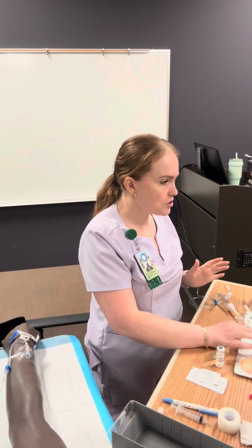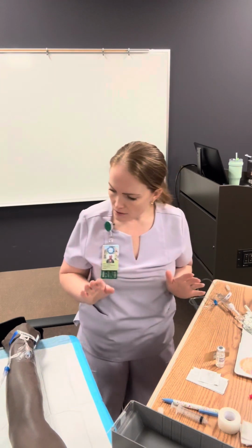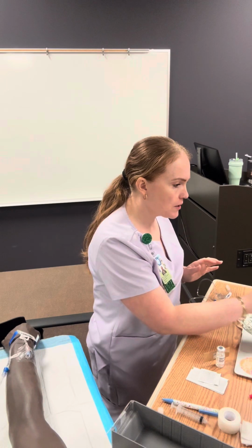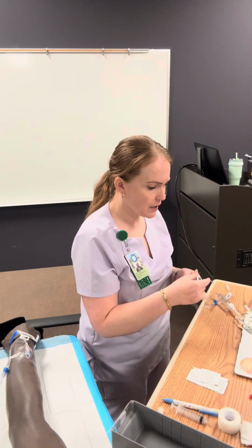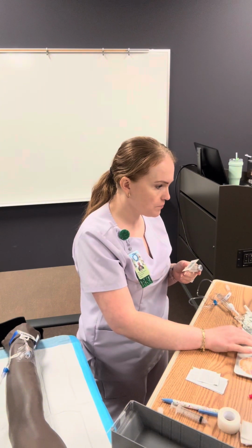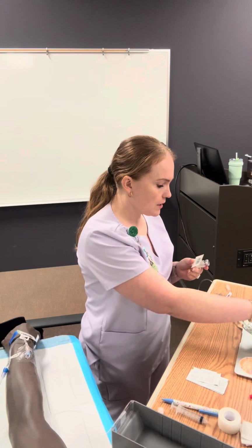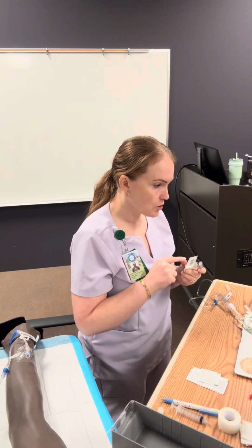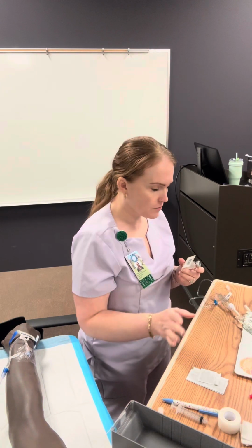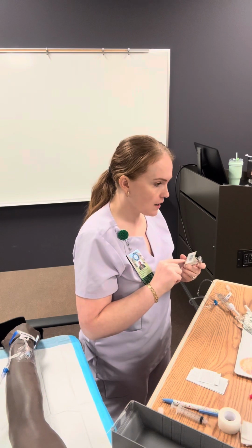Let's do med check 3. I have the patient code brown 61851. I see here code brown 61851. The first medication is ondansetron. I'll scroll down in my file until I find ondansetron. And I see ondansetron. The dose that I have on hand is 2 milligrams. It is ordered 4 milligrams, and I have 2 milliliters pulled up. The route is IV push.